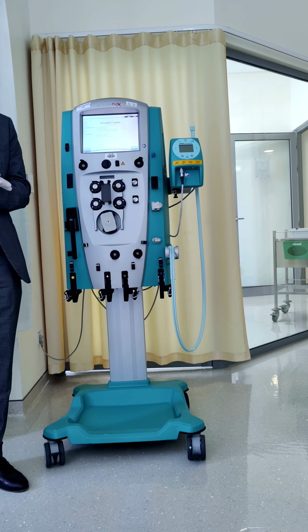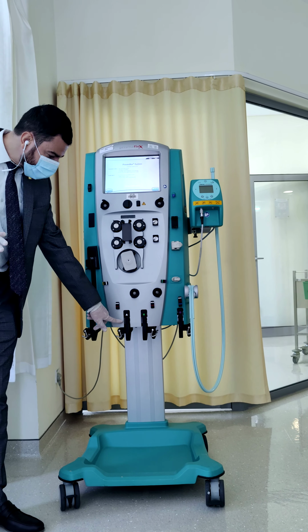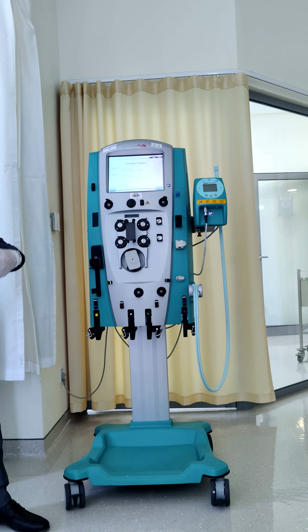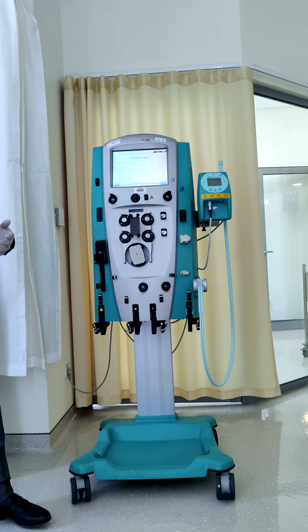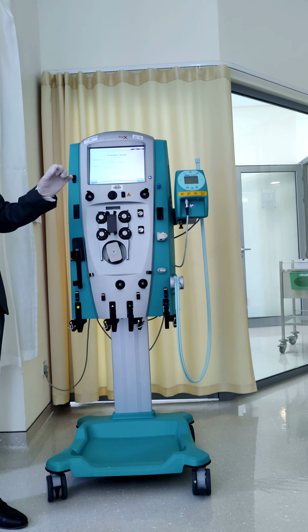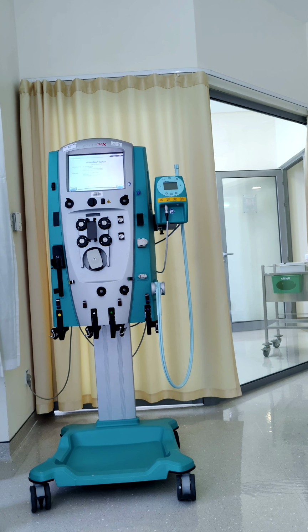Okay, sixth point now, important point about the pre-blood pump bag. The pre-blood pump bag is a dilution bag or a dilution solution to dilute the blood a little bit. Maybe it will help to avoid the clotting also. But very important point, you can highlight it: in any pre-blood pump dose you will give, the machine will not remove it again from the patient.